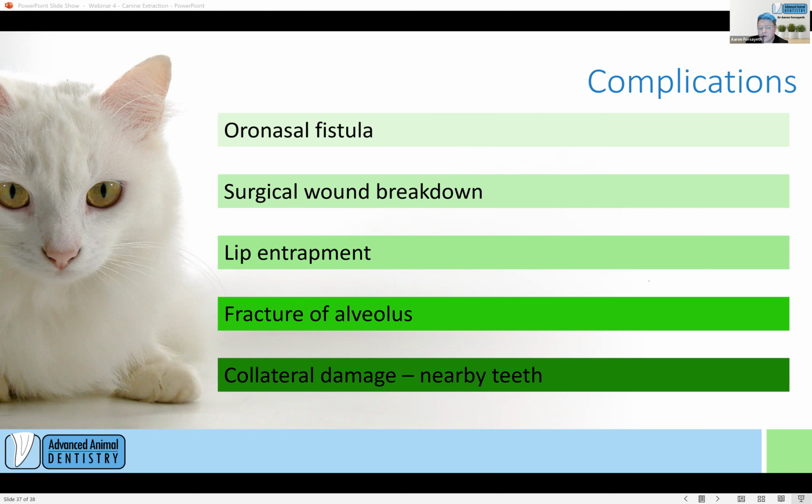The way to resolve it is we need to unfortunately deal with the tip of the mandibular canine, and it needs to not be there. So there's only 2 ways for it to not be there. One is complete removal of the mandibular canine. The other is, if you want to send them our way, I guess we do a mandibular height reduction.